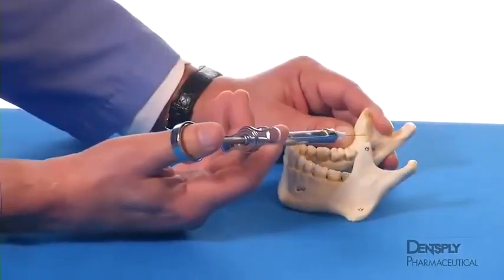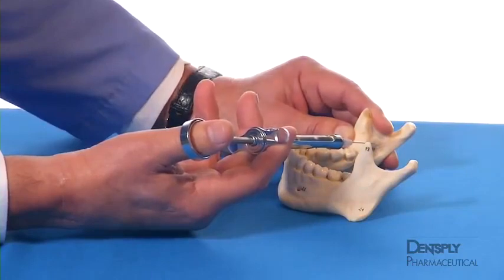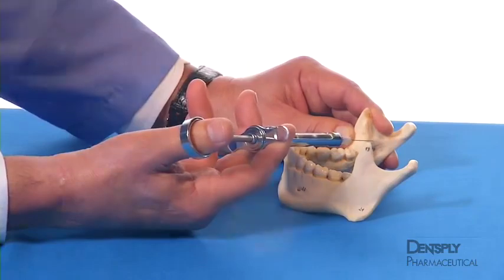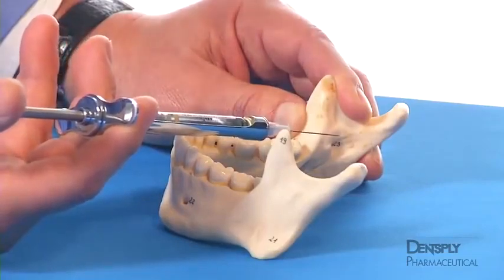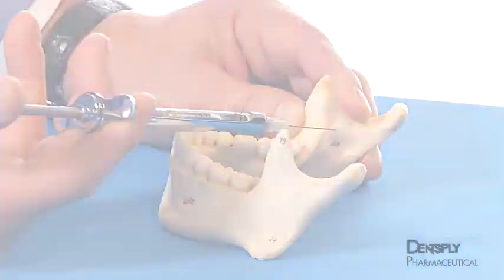With the syringe held parallel to the mandibular occlusal plane and at the level of the coronoid notch, the needle will be in a plane that intersects the mandibular sulcus unimpeded. Because of the lateral flare of the ramus, the syringe must be advanced from the contralateral premolar region for the needle to enter the sulcus.